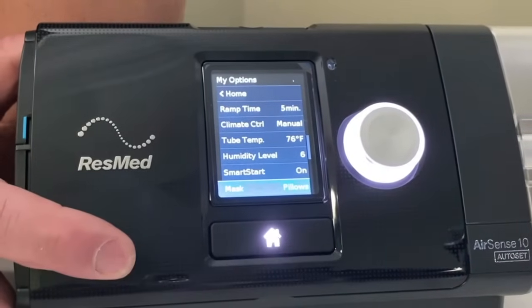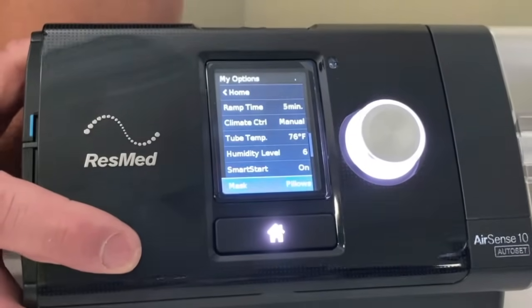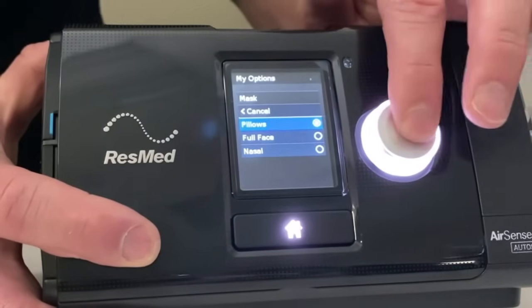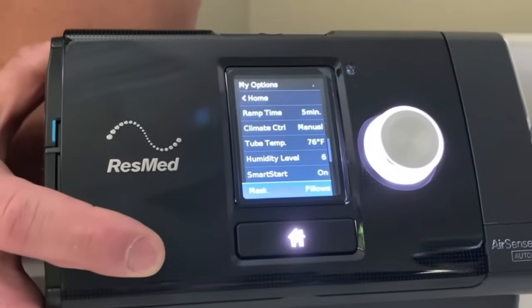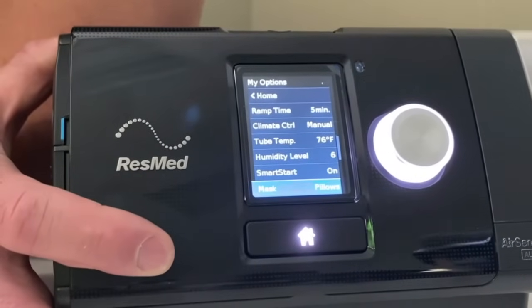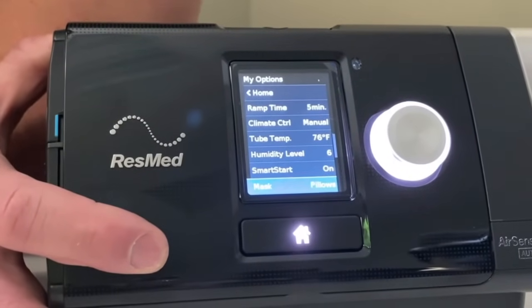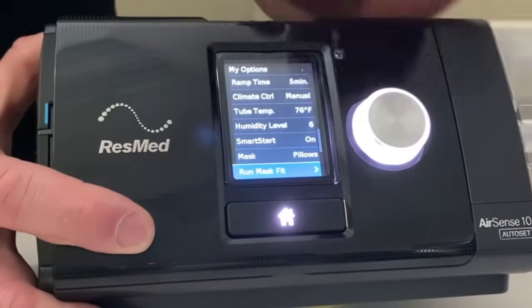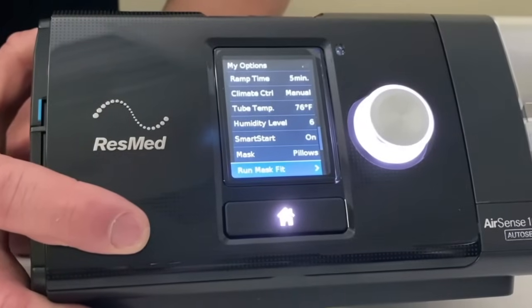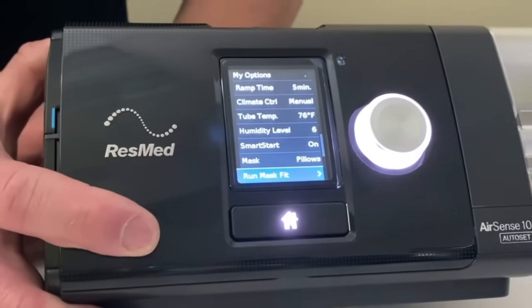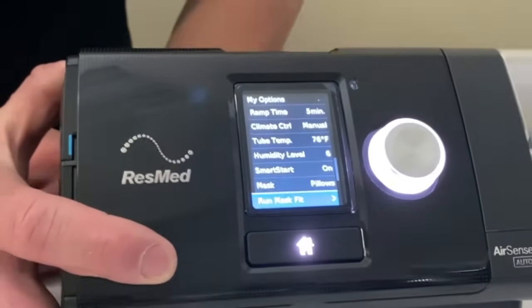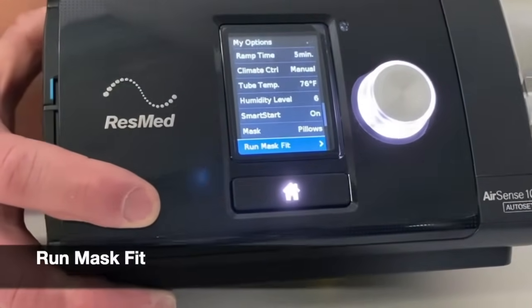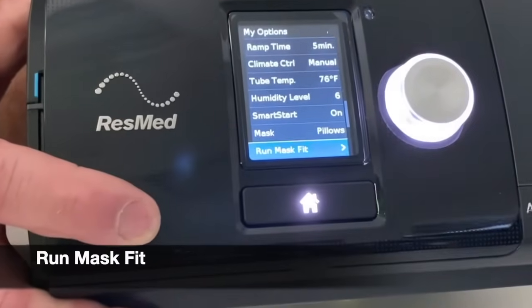The next one down is the type of mask you're using. Right now it's set to pillows, but you have three options: nasal, full face, and pillows. This setting is mostly for intentional leak reporting — what I see on my end in the reports. If you don't have it set to the right mask type, it's not going to harm your therapy a lot or change it significantly.